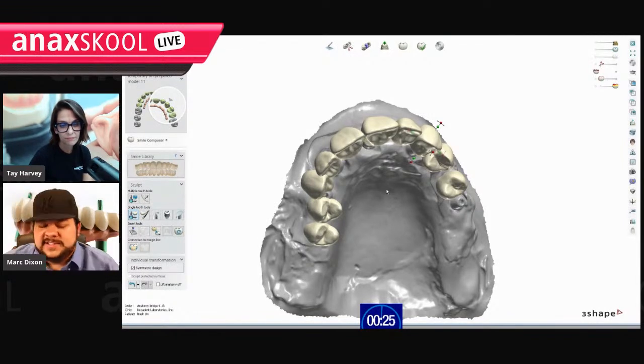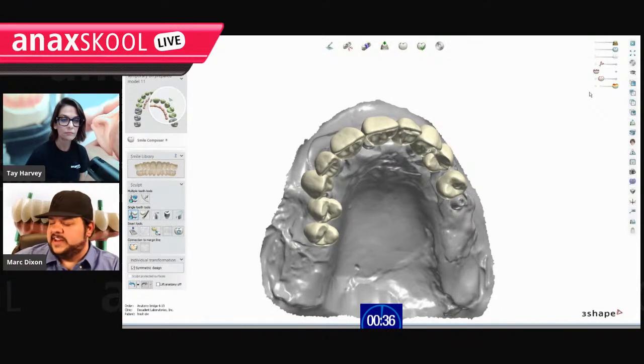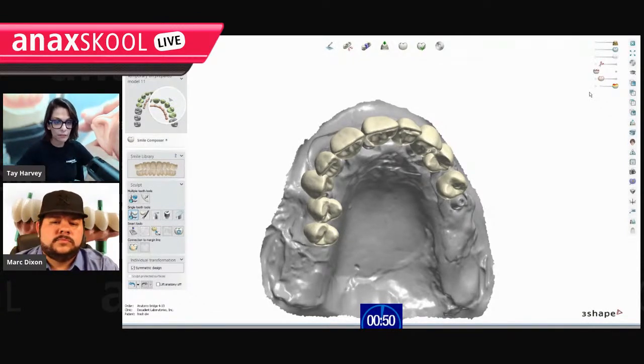There's nothing going on. It's not saving anything except for a little bit of this, a little bit of that, and a little wax on and wax off, and that's it. So you can close this order and open this order and send it to a friend and export it all day, every day. And you're never going to have a problem reopening it and redesigning it swiftly. No errors. There's nothing to err out of that design tree. You give yourself all this flexibility.